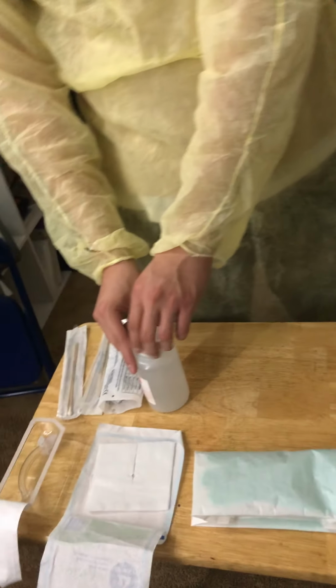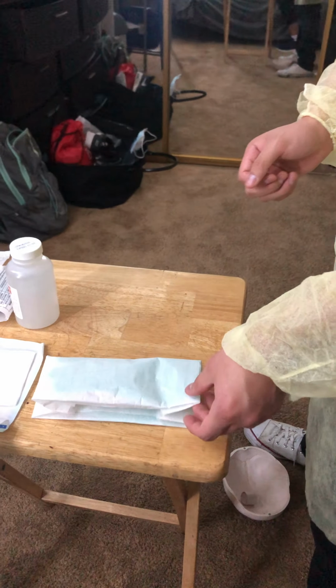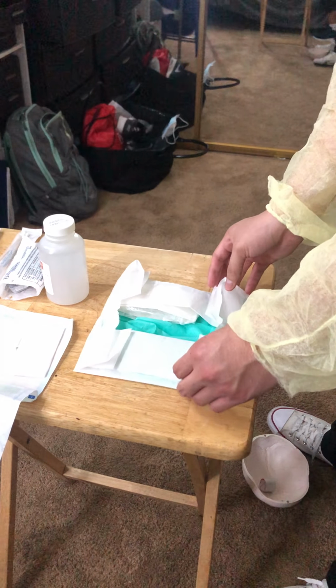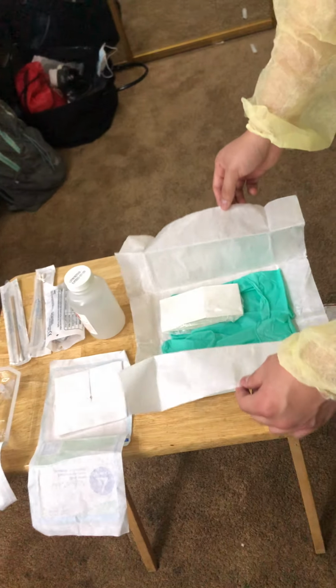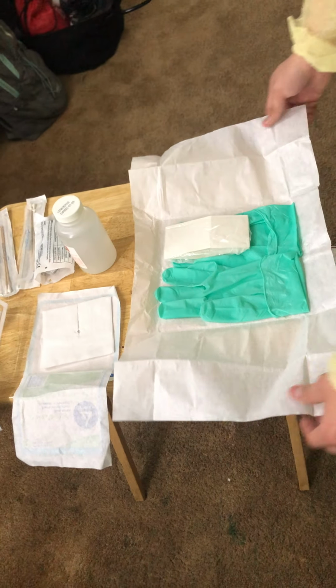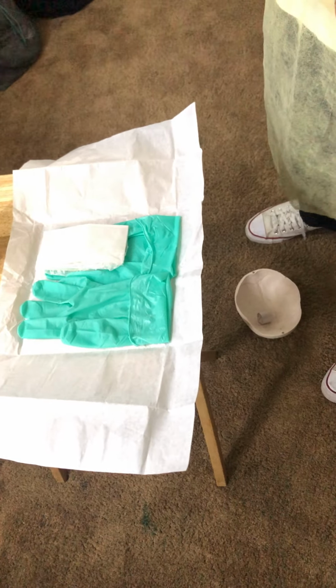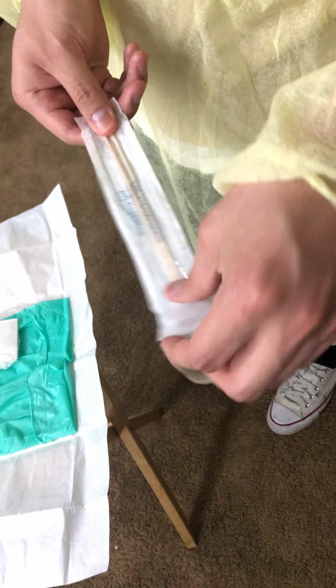Open my sterile. Grab the 1-inch border. Grab my Q-tips.